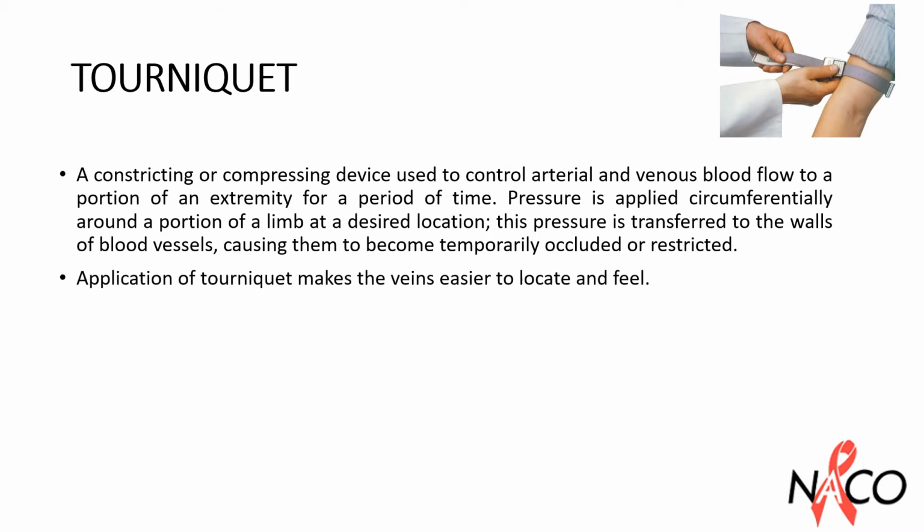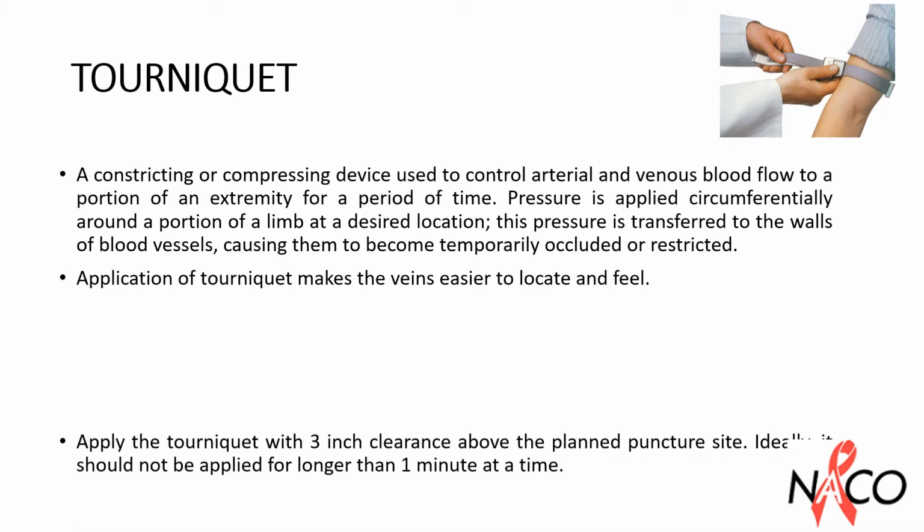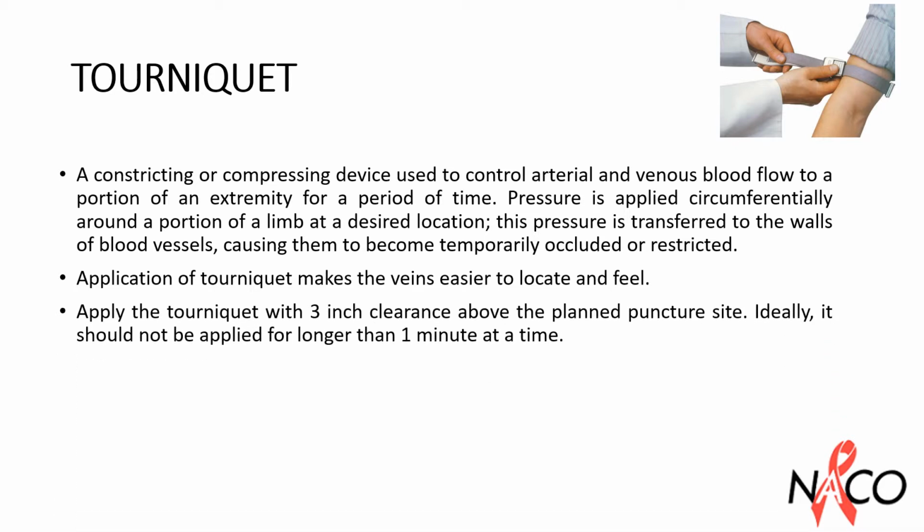Application of tourniquet makes the veins easier to locate and feel for sample collection. Apply the tourniquet within 3-inch clearance above the planned puncture site. Ideally, it should not be applied for longer than a minute at a time.